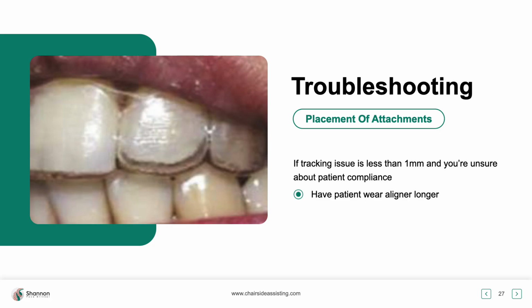I know what I'm talking about here, and what I'm telling you is, when you were on aligner 2, 3, or 4, you lost an attachment. Sure, go back to the original template. But when you are past 7, 8, 9, you never, ever use the aligner to place the attachment or use the original template. Now, why is that? Remember, the template is something that we're utilizing originally out of the gate to place the attachments. And the aligner is for movement. If you use the last aligner to replace an attachment, do you know what's going to happen? You are going to compromise the movement.